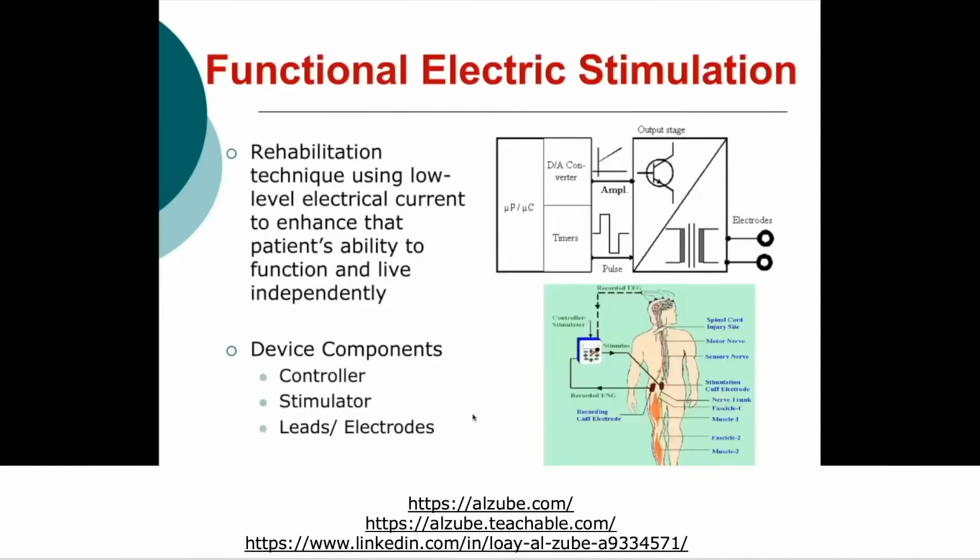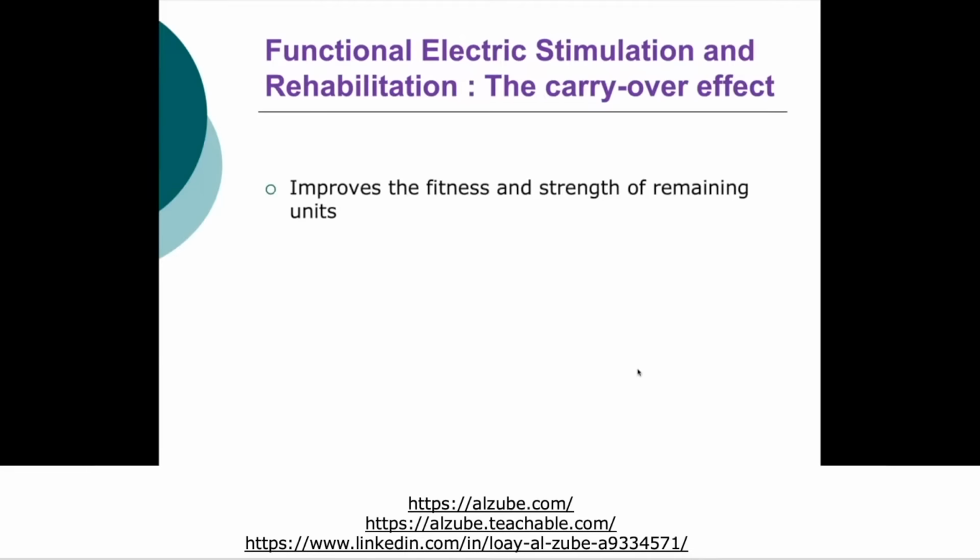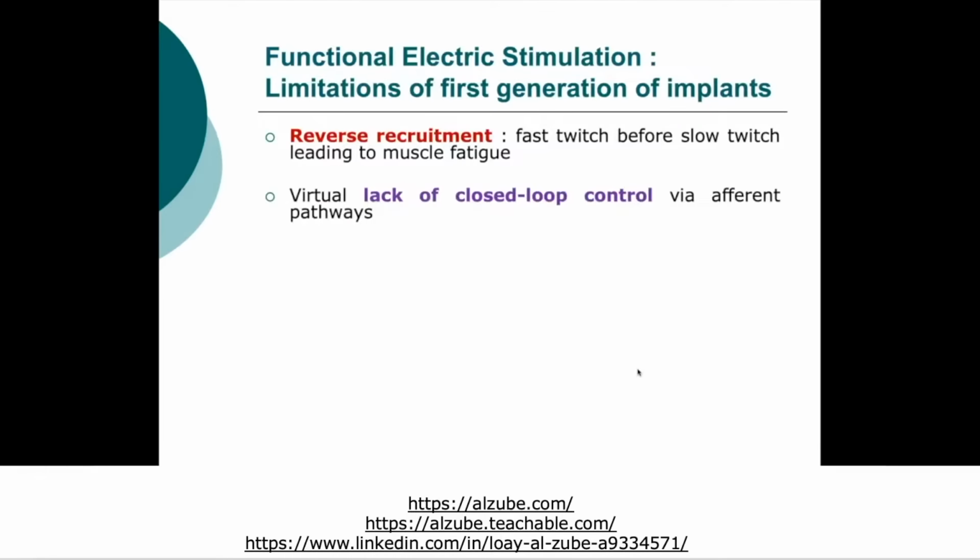And what I mean by that is that when we were sending the signal to activate the muscles, we read that from the EEG, we have the controller, the controller will do stimulation, and then this afferent pathway is the signal that is going back, a sensory signal that goes back to the brain. But because we have the injury here in the central nervous system, we don't have that pathway. We can measure some feedback, but it's going to be very weak in order to modulate or affect the stimulation. And that was a challenge that needs to be solved in the next generations.